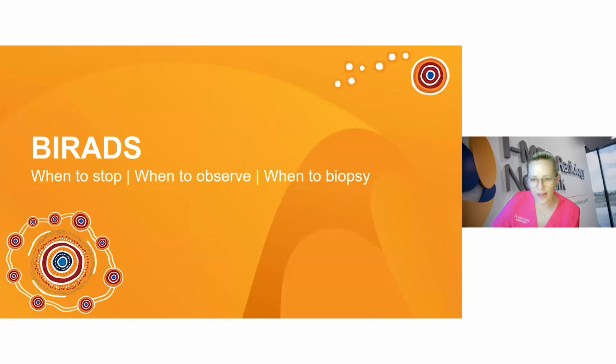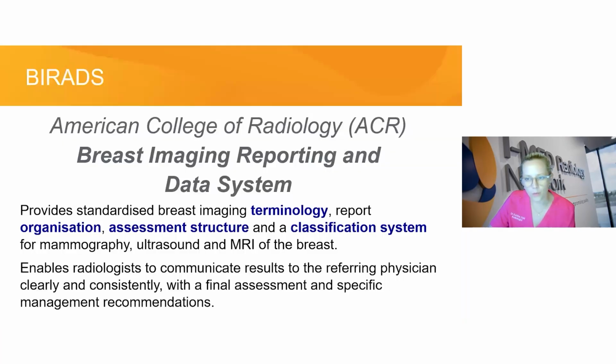So next step on our journey is BI-RADS. Now, my aims here are to give guidance about when to stop imaging, when to observe, and when to biopsy. As you would be aware, we have all the RADS. So all the RADS are from the American College of Radiology guidelines, and the RAD is a reporting and data system. So there's BI-RADS, there's TI-RADS, there's LI-RADS, there's PI-RADS. We all have a RADS. We've got O-RADS now as well.